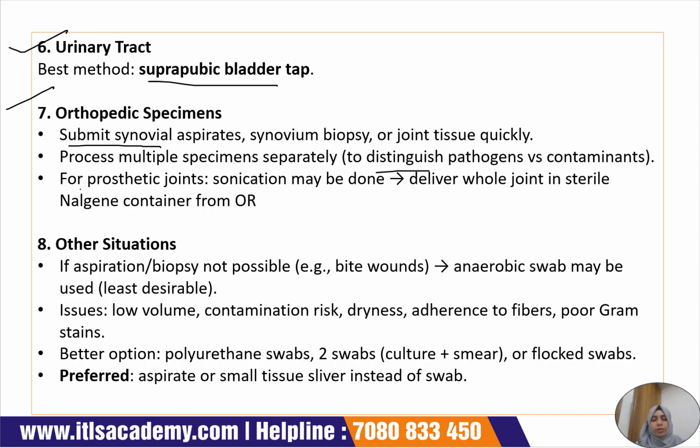For prosthetic joints, sonication can be done, delivering the whole joint in a sterile Nalgene container large enough to contain it, from the operating room.